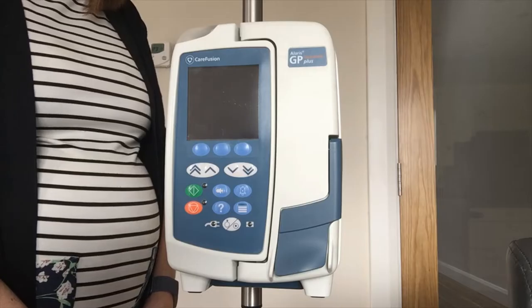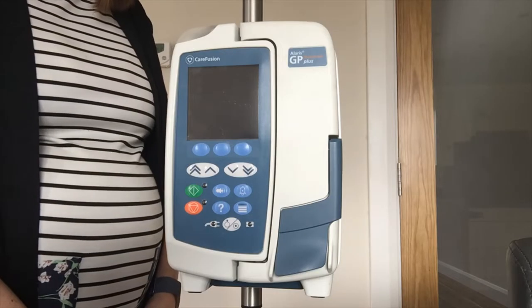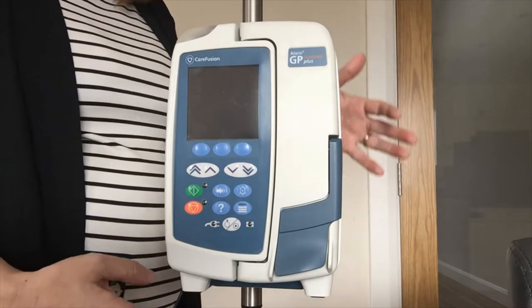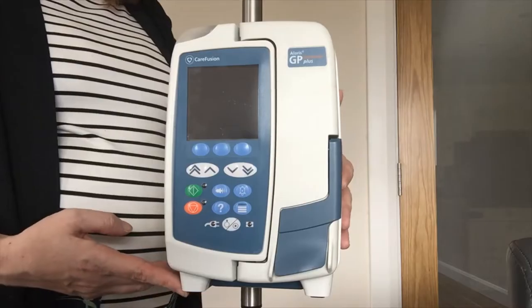BD volumetric pump training. For the purpose of training I am using the GP volumetric pump. Before you use any pump please make sure that they are clean, intact and have no cracks that any fluid can get into, so visually inspect your pump.